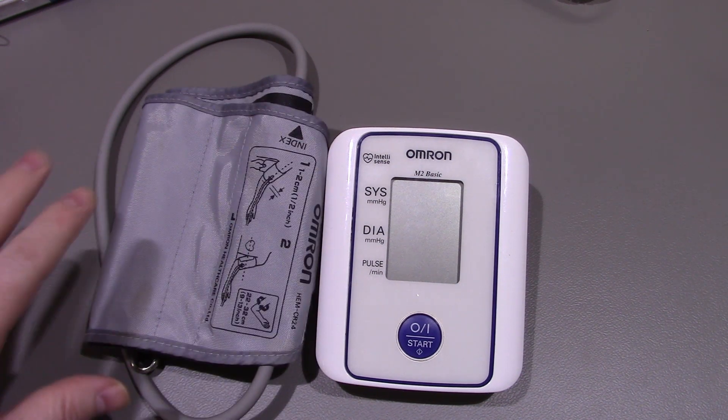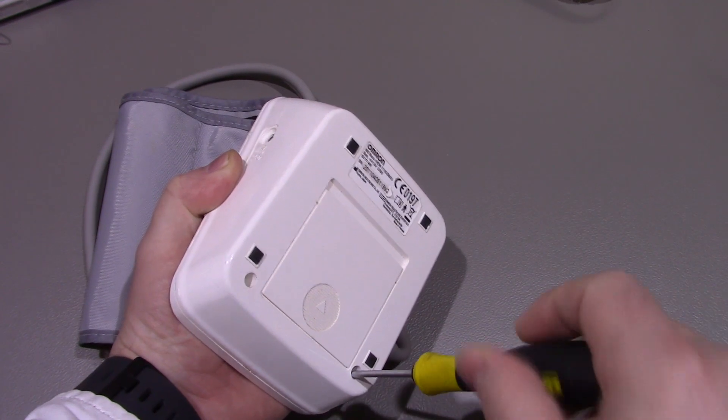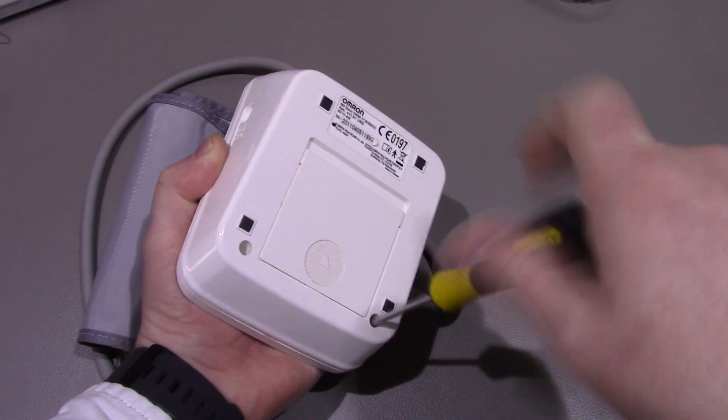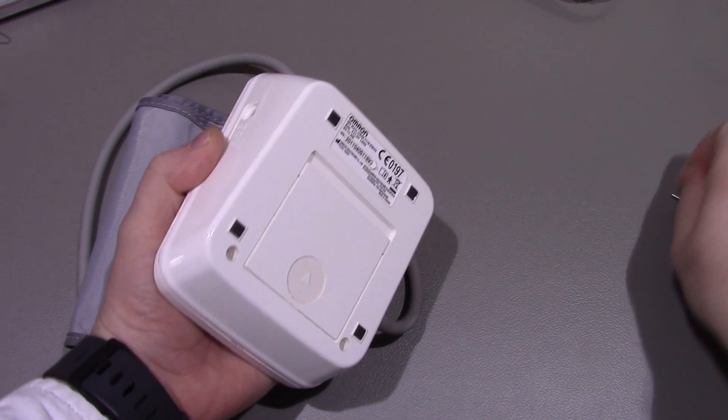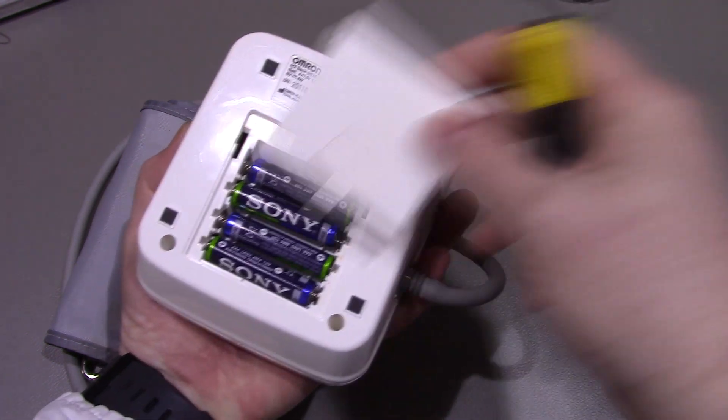I have had it apart before and looked around, but I thought it would be interesting for you guys to have a quick look inside and see what they put into one of these. You've basically just got two screws at the bottom there. This is your battery pack - it's four AAA batteries.